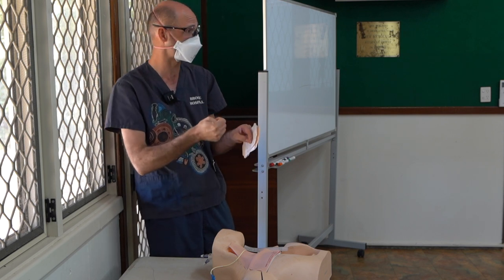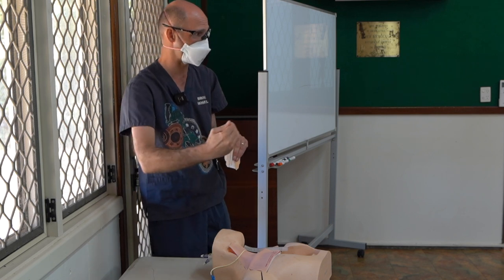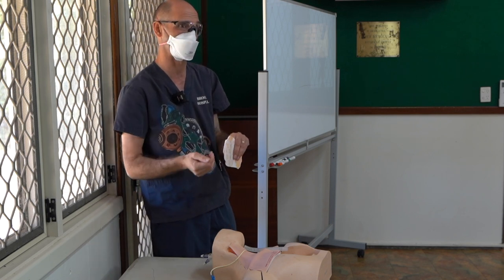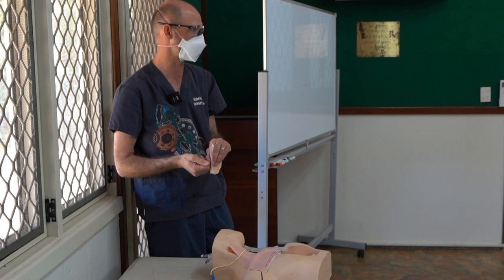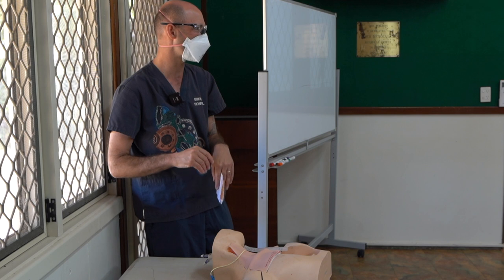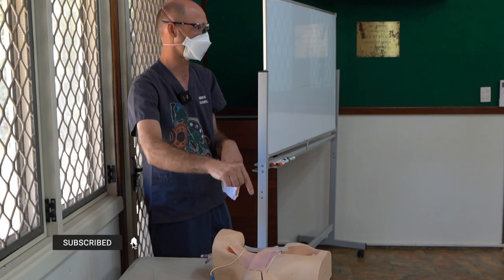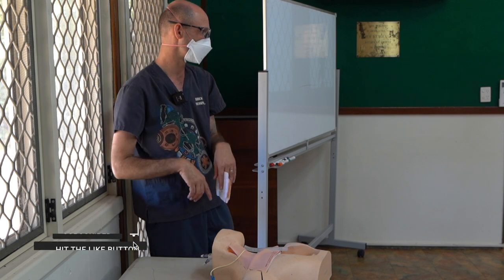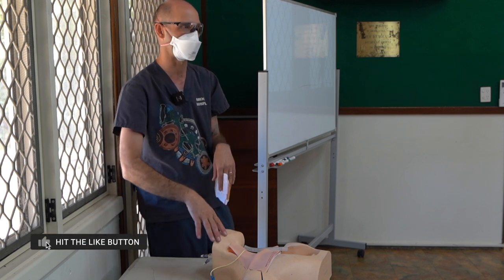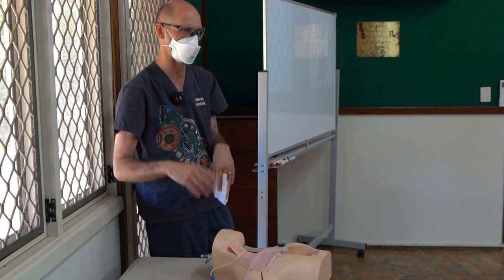If you pull back and bright red blood comes out, it's not good. And if you ultrasound it and can't see it in your vein, it's probably not in the right place either. So those are the three things — anything that just doesn't feel right, stop and start again. There's no harm in stopping and starting again. You can give vasopressors while you do all that, or come back to it in a couple of hours when the patient's more stable. For us, there's no great reason to have to do it quickly.